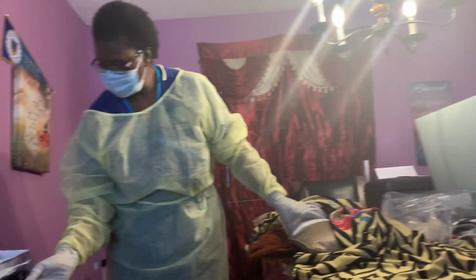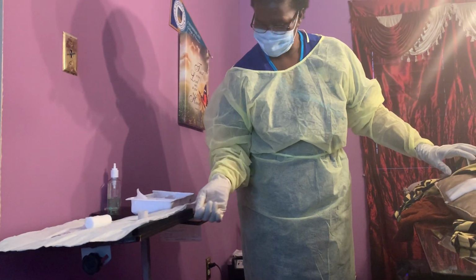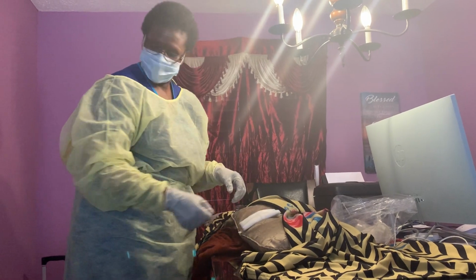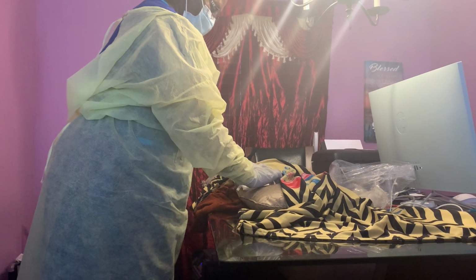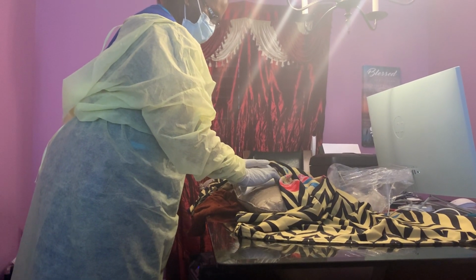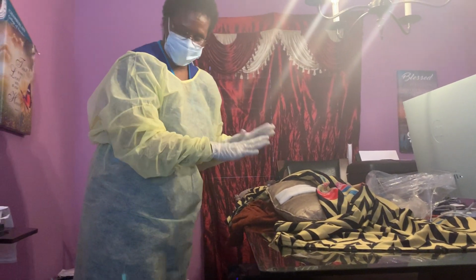I'm gonna take my tape, which I've already prepared, and then tape my wound. Take the other one, tape across, and make sure it is well suited. So the wound is dressed and the wound is covered.